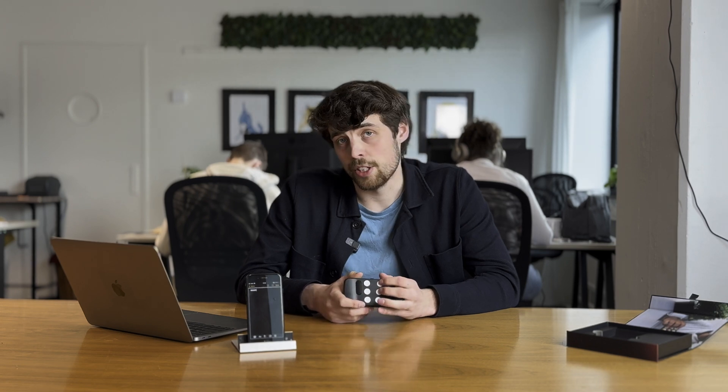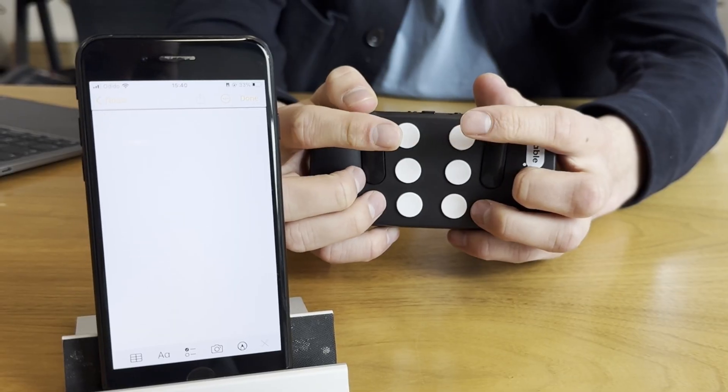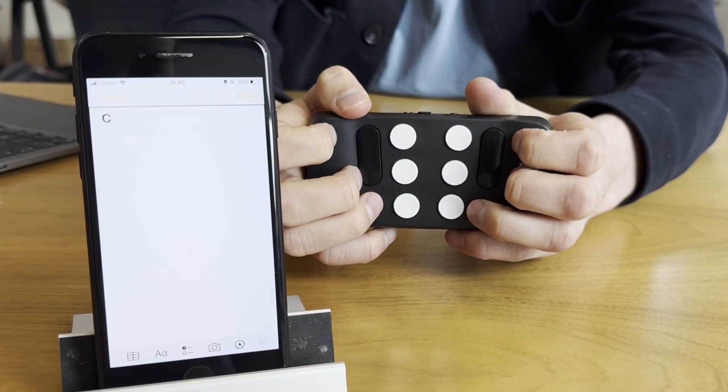When we go to the B, we have to use two buttons at the same time — button one and two at the same time will be the B. When we move to the C, it's again two buttons at the same time — button one and button four. Now just try if you can remember these three: practice a few different combinations, typing A, B, and C.